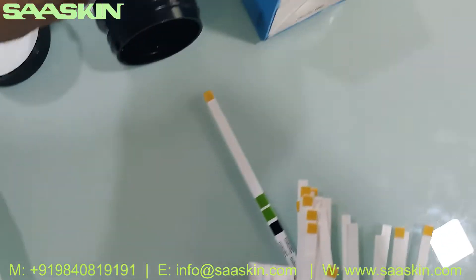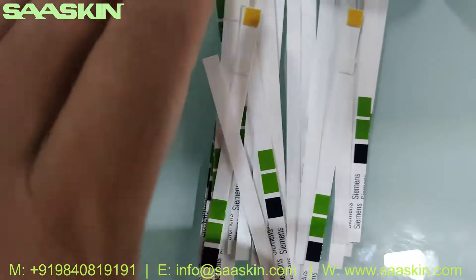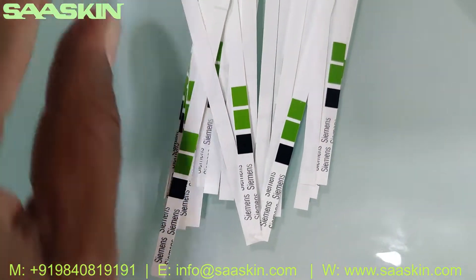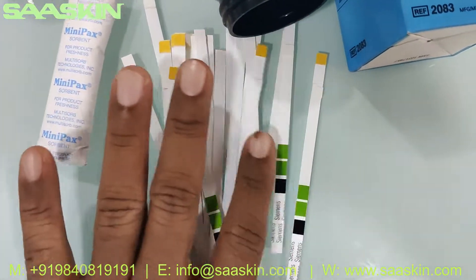Here you go — you can see the strips. There are 25 strips, and there is also a sorbent inside the bottle along with them. This is what all the strips look like.